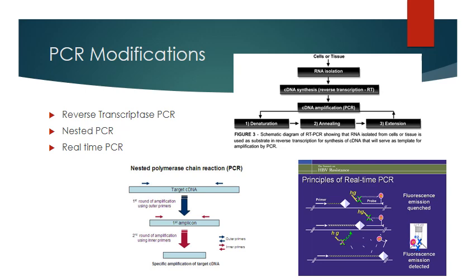So if a doctor wants to know not just does the patient have HIV, but how much HIV are we talking about? What's the viral load? The implication would be that the higher the viral load, the worse the clinical symptoms the patient would be experiencing. That doesn't necessarily always ring true, but it is something that doctors want to know.